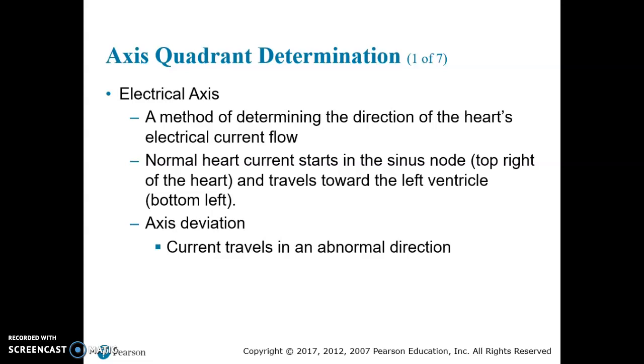Chapter 13, Video 2. In this video, we're going to talk about axis quadrant determination, and I'm going to go over with you guys how it's used in relation to the previous video. So, knowing the correct deflections of the lead you're looking at is very important to understanding how to determine the axis quadrant.